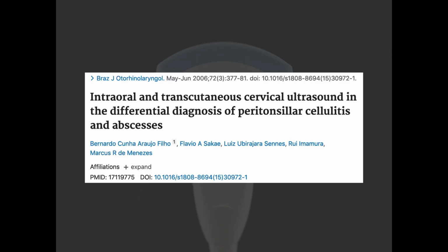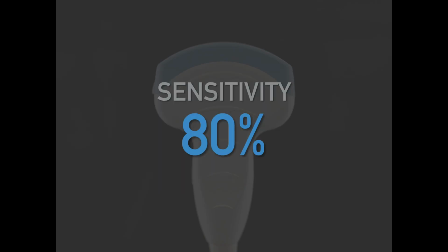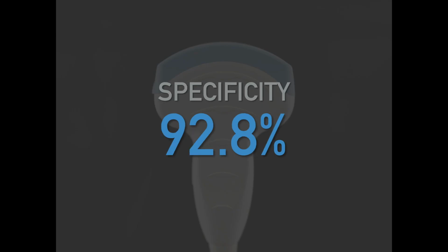And there's been a couple of studies that actually looked at intraoral versus transcutaneous approach, and it's interesting because they have different strengths and different weaknesses. So the sensitivity is a little bit lower, it's around 80%, but the specificity is actually a lot higher, which is kind of interesting, and I think some of that is you get a pretty decent view, and when you see it, man, it's a slam dunk.